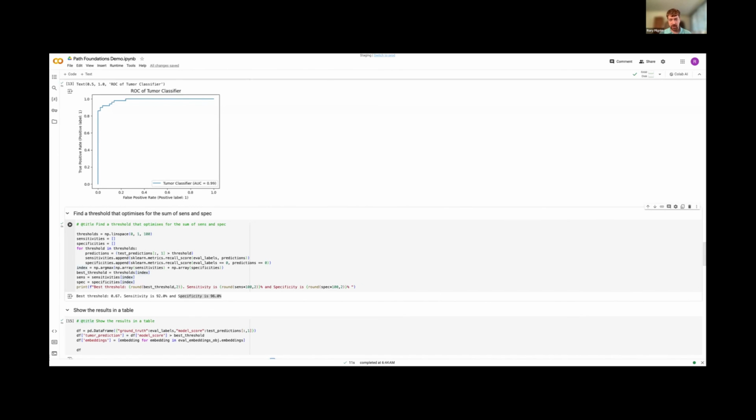In terms of the tissue classification, what we hope at Google is, as people build these things, they can actually share the linear classifiers, and then you could share it with your lab down the road or colleague, and they can run the same thing and it'll work, right? They can generate the same embeddings, recognize them the same way. So if somebody was to build a lung tissue classifier, you could just share that and say, here's the weights, there's 384 numbers, and this will convert my embedding into a lung tissue identification.